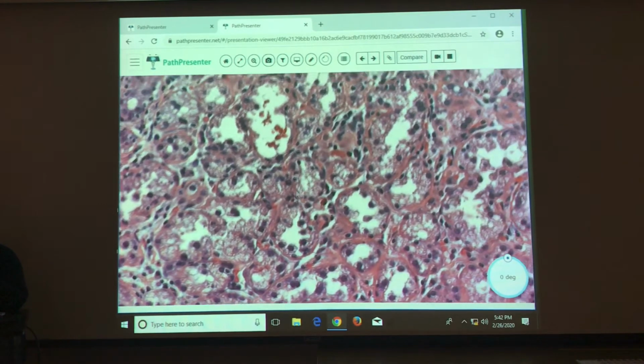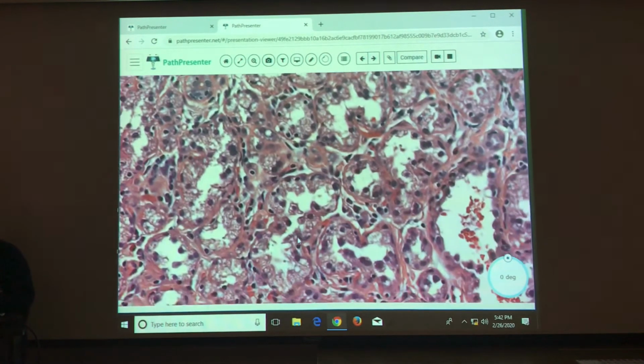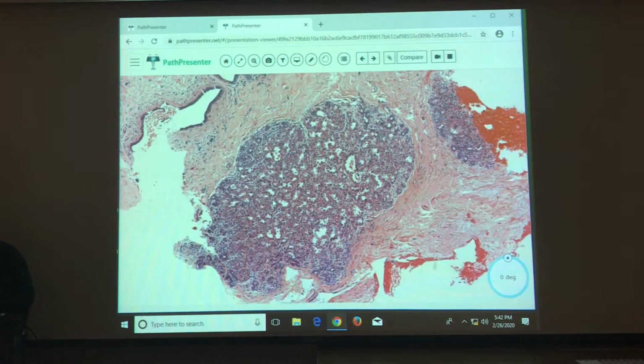Galactorrhea. Sorry? Galactorrhea. You're very close. Okay, so, all right, we have, let's say, a 24-year-old female, and she is first trimester and feels a mass. Just gestational change of the breast. Yeah, lactational change. So I have a couple pictures in your handout about lactational change and some of the things you can see in early pregnancy.